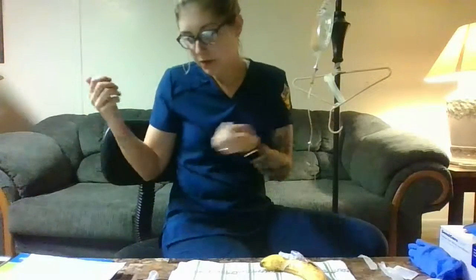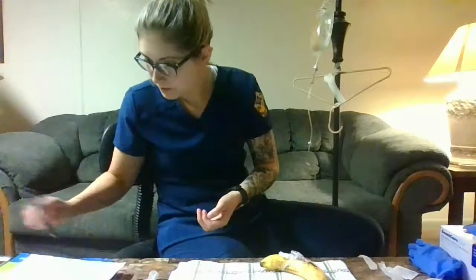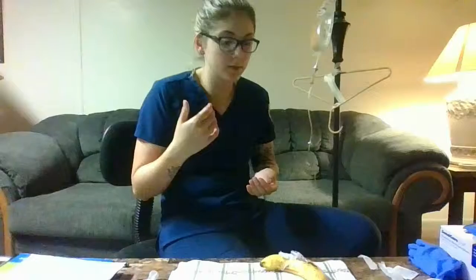And then you're going to document in your chart that you flushed it with 5 mils, saline locked, IV site looks good. Ask them if they have any questions. Give them their call light.